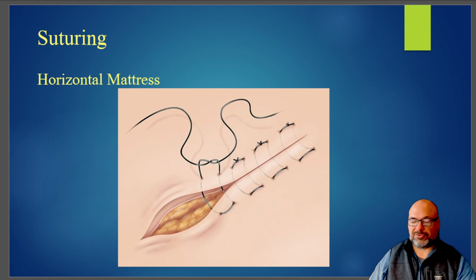at mattress sutures. So, we don't typically do interrupted mattress sutures much, of which there are two varieties, horizontal and vertical. But we occasionally use just that approach to the tissue in more of a running suture, especially the horizontal, but let's see what we're talking about here.